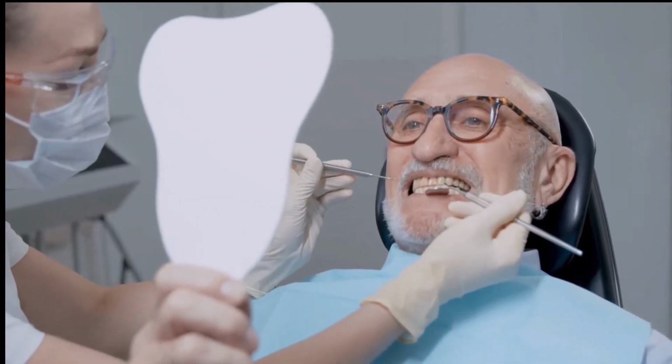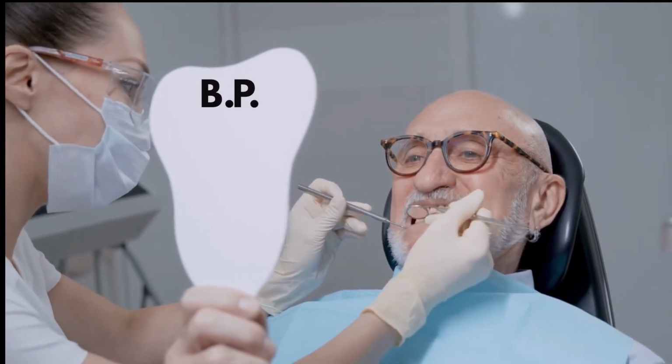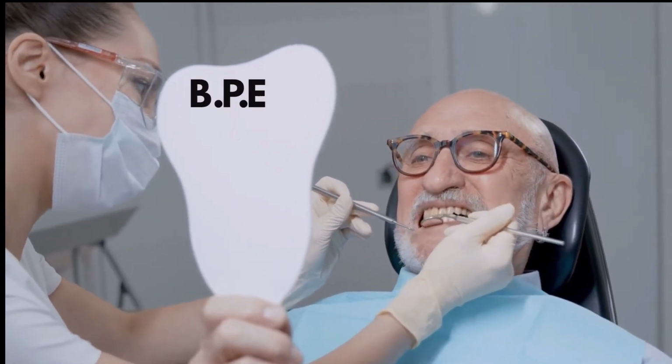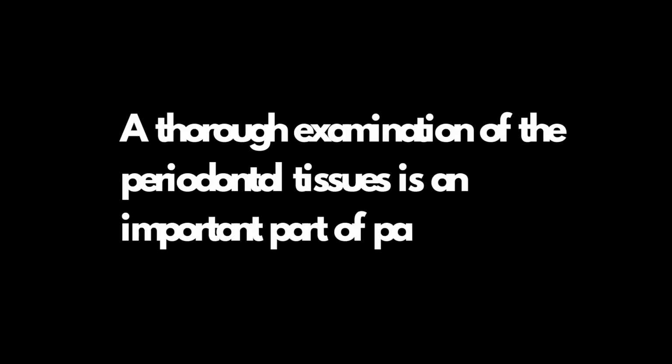Today we are going to be looking at the basic periodontal examination, the BPE. The BPE is basically a basic screening tool for determining a patient's periodontal condition. It's a simple technique that should be performed on all patients in order to rapidly identify any periodontal problems. A thorough examination of the periodontal tissues is an important part of patient care.